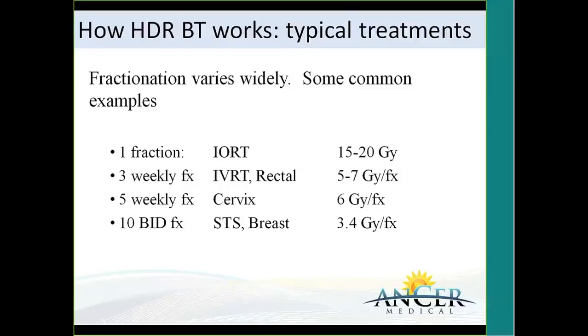However, having the source or catheters right inside the tumor allows you to deliver much higher doses than you will ever be able to deliver safely with either SBRT or SRS. The problem is that this is invasive, so you may not always be able to do that.